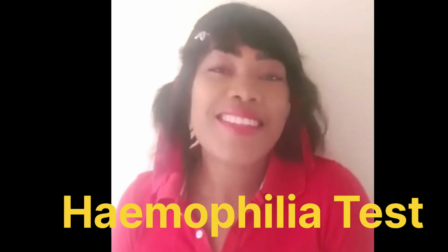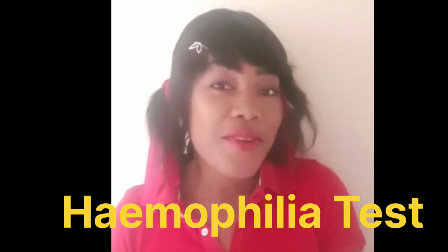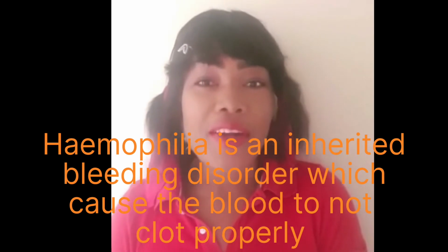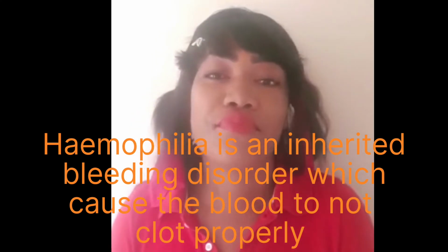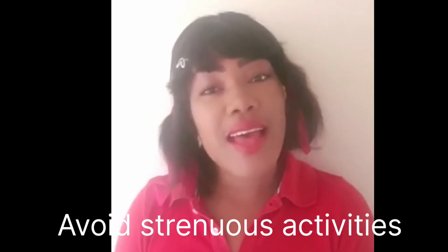Good day, class. Today I will be presenting on the hemophilia test. First, hemophilia is an inherited bleeding disorder which causes the blood to not clot properly. To test for hemophilia, you must first prep the patient. The patient must avoid ASA, most popularly known as aspirin, and avoid strenuous activities prior to blood draw.